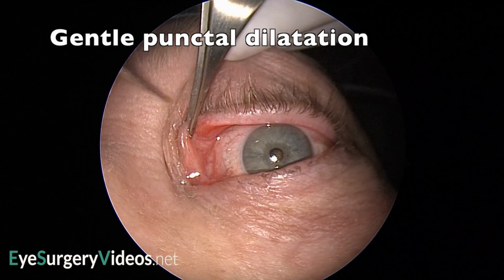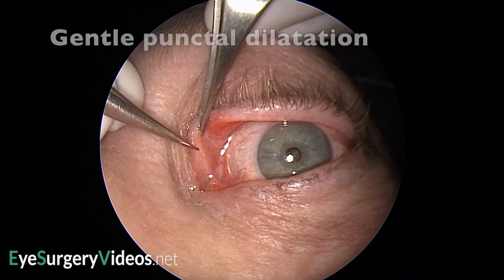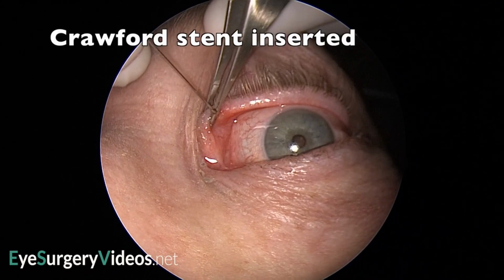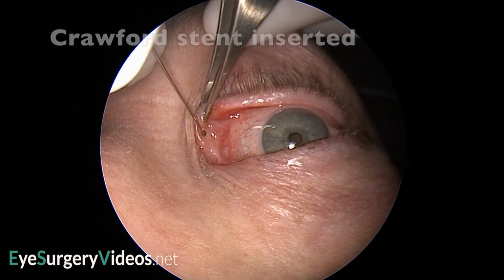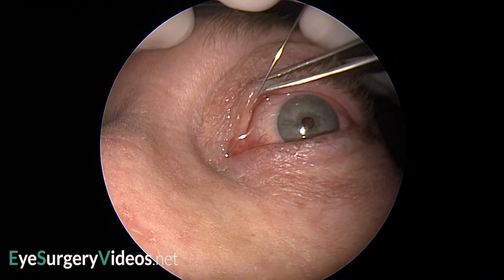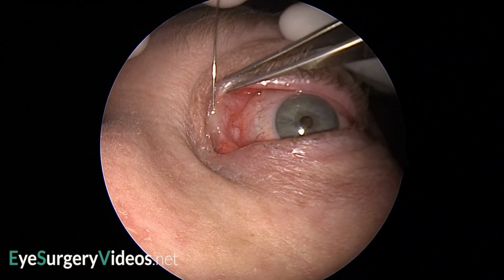One should be familiar with the anatomy and direction of the system while performing stenting. Upon entering the punctum, the stent should pass through the vertical canaliculus, which measures 2 millimeters in length and extends perpendicular to the eyelid margin, before widening to form an ampulla. At the ampulla, the canaliculus makes a 90-degree turn medially. The canaliculus continues horizontally for 8 millimeters following the arc of the eyelid.